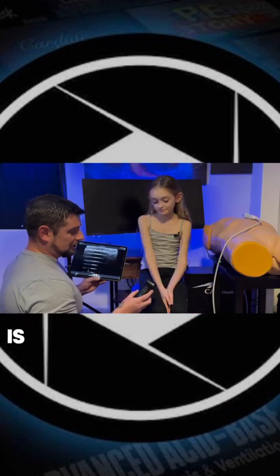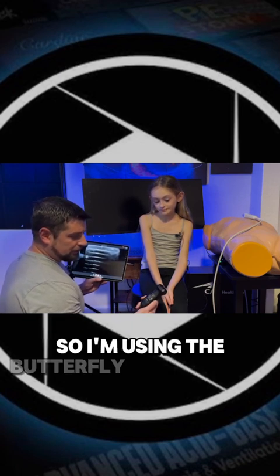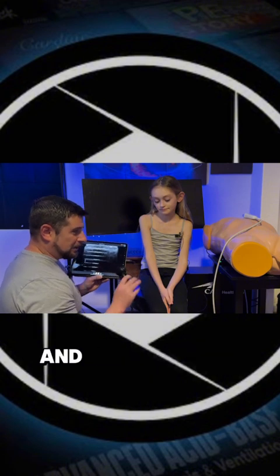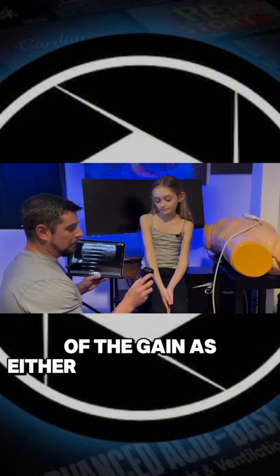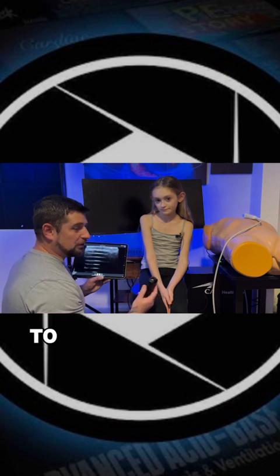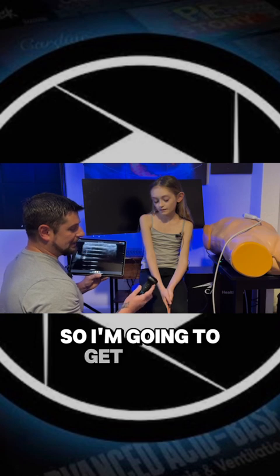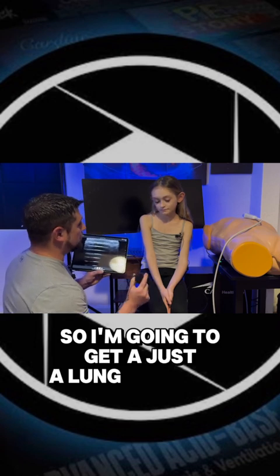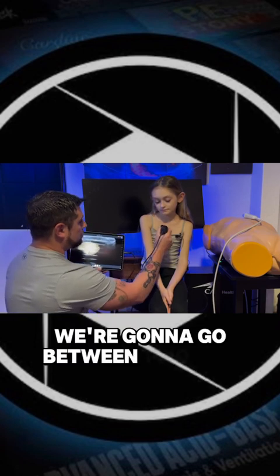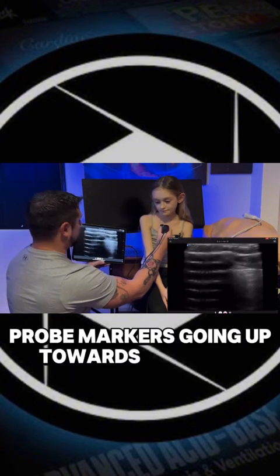What I'm going to do is demonstrate how the gain works on the probe. So I'm using the Butterfly IQ3 here, and you can think of the gain as either making the probe more sensitive or less sensitive to the sound that's being reflected back to it. So I'm going to get just a lung view here. We're going to go between two ribs, right? So I put it on right here, probe marker going up towards her head.